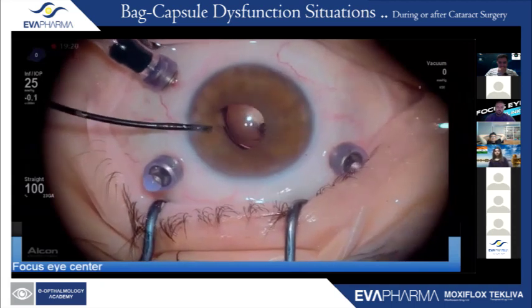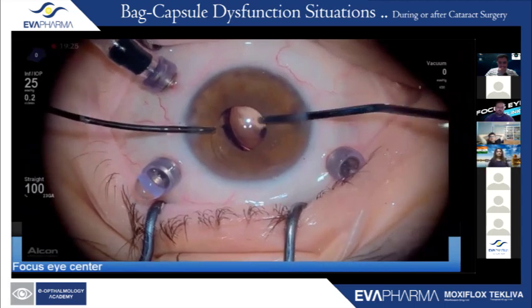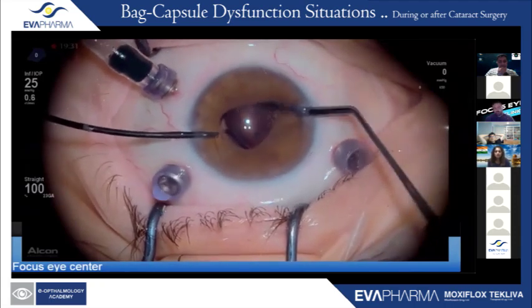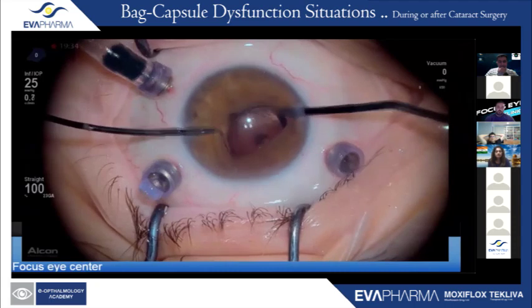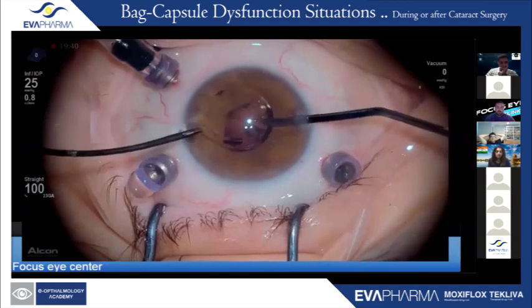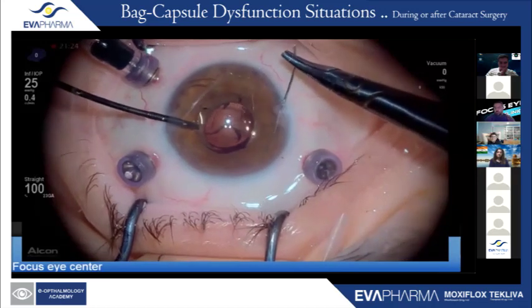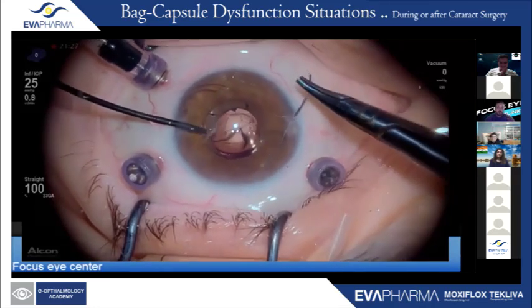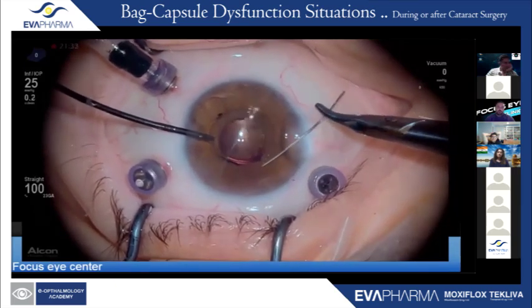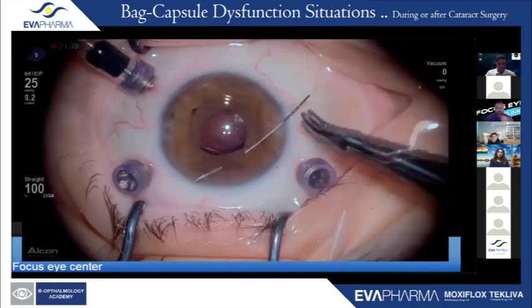So this is a single piece hydrophobic IOL, which again can be sutured to the iris in elder patients. There were some concerns for iris chafing or UGH syndrome, but I haven't seen that in my practice. And recently I talked with Ahmed on the matter, and he also doesn't seem to find a problem with such fixation. Why? Because the lens is fixated to the iris and doesn't move. So it's completely different than a single piece IOL in the sulcus. It is fixated on the iris.